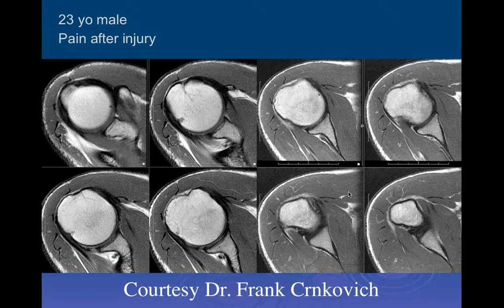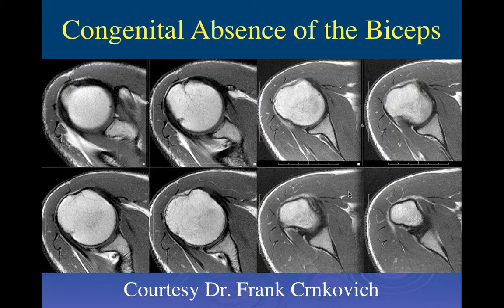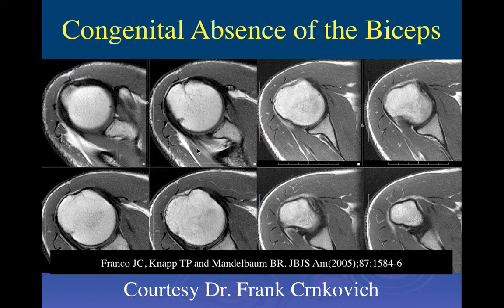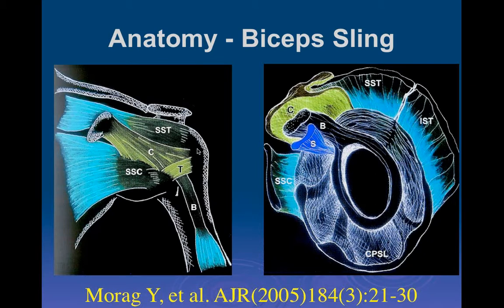Here's a 23-year-old male with pain after injury. Looking at multiple axial images, there's no biceps tendon visible and also no well-developed groove. This is actually a rare congenital absence of the long head of the biceps tendon — the short head is still there. The absence of a well-developed groove is the important diagnostic clue; otherwise it would almost always be diagnosed as a tear with distal retraction.